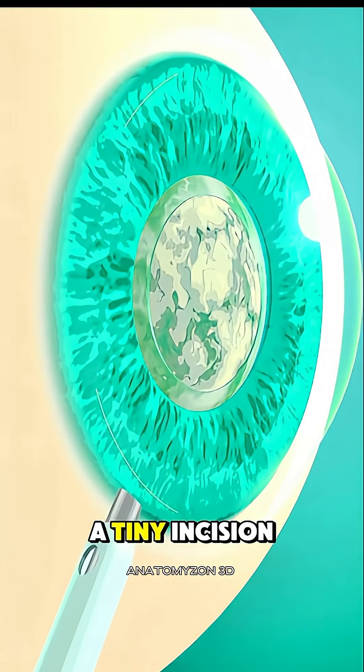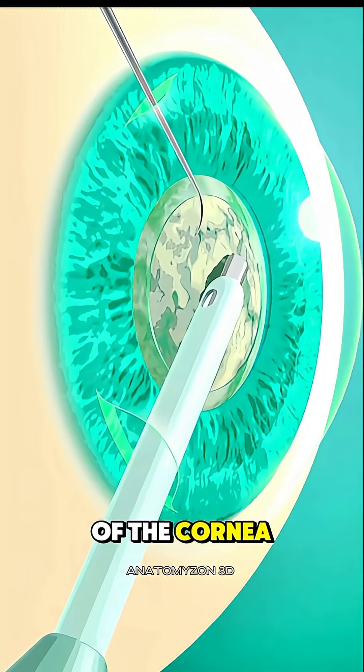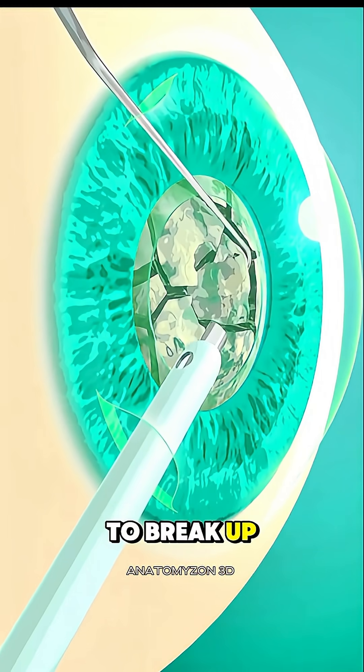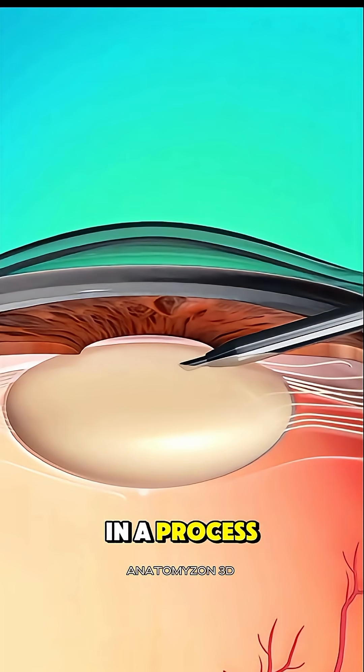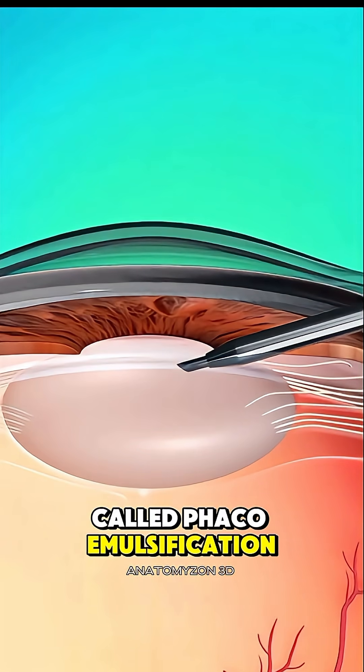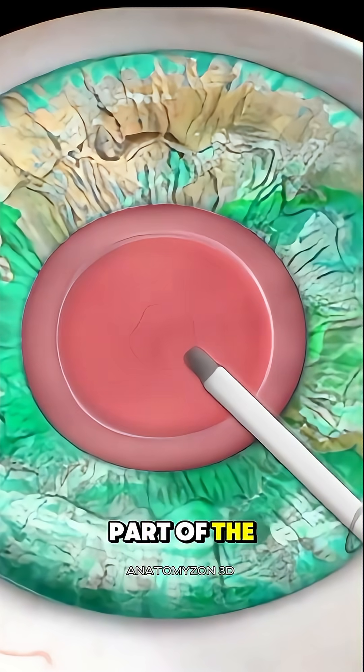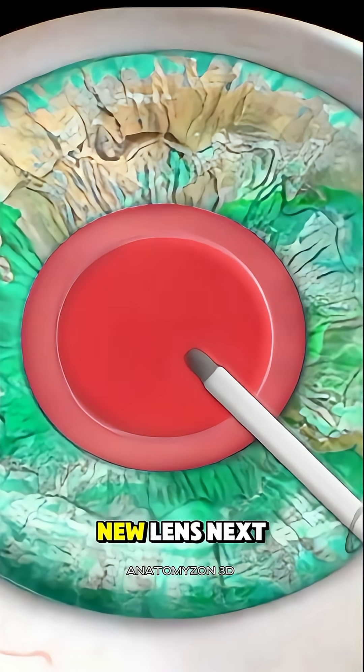The surgeon makes a tiny incision at the edge of the cornea and inserts a small instrument that uses ultrasound energy to break up the cloudy lens into tiny pieces in a process called phacoemulsification. These fragments are gently suctioned out, leaving the back part of the lens capsule in place to support the new lens.